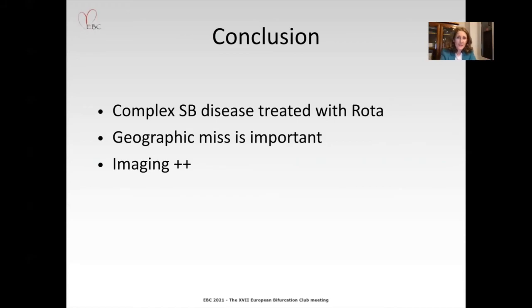And should that mandate a stent in this case, particularly when we're talking about the left main and the amount of myocardium that's subtended? And how important is imaging in this particular case? If we decide that we're not going to stent it, do we need to do imaging to actually support that decision? Or is the angiogram in itself enough?